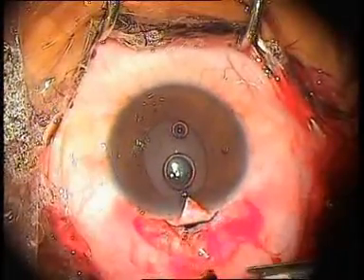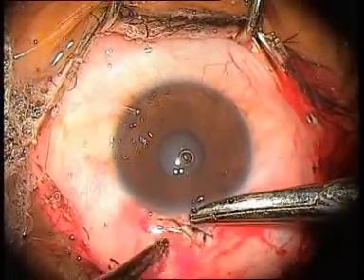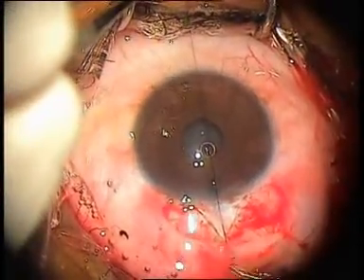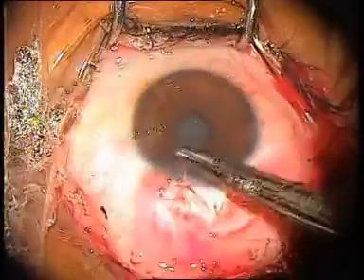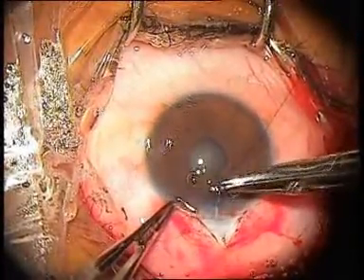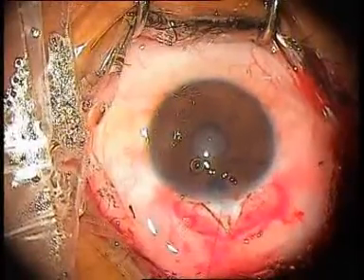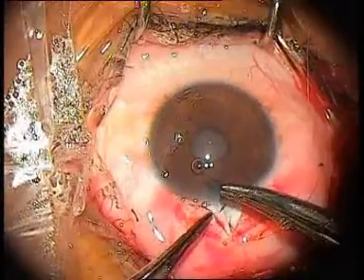To avoid postoperative hypotony, sutures are placed around the margins of the flap, which can be fixed sutures or releasable sutures. This video highlights the placement of sclerocorneal releasable sutures. First, a sclerocorneal reverse bite is taken. The second bite is a corneoscleral bite taken 2 mm away from the initial bite. It should be a partial thickness superficial bite to avoid buttonholing at the base of the flap.